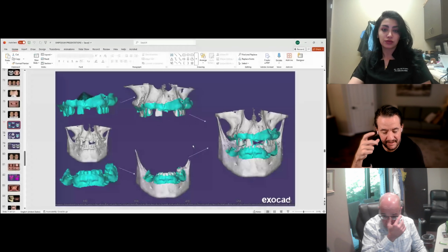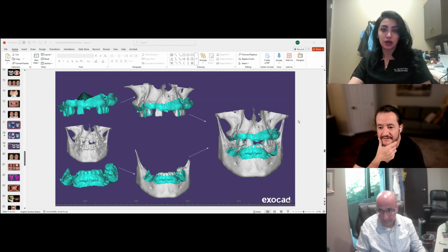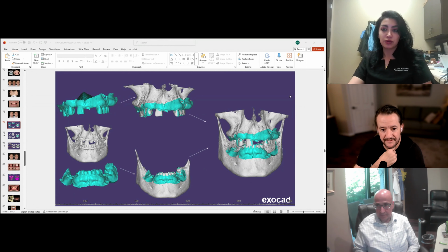I love that. Well, Dr. Ola, could you just walk us through your workflow maybe quickly? So you're taking CBCT and photos and you're importing those into XNAV. I don't know a lot about XNAV. I assume you are doing some pre-planning, and so you have a plan going into surgery. And then the XNAV is guiding you with feedback in the handpiece into the position you need to go.